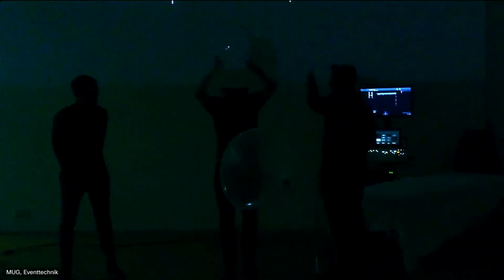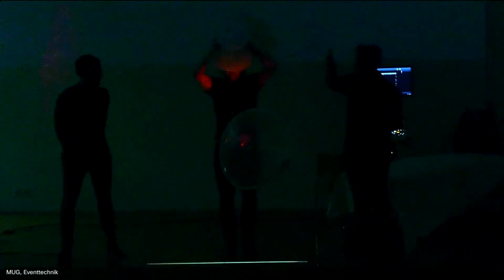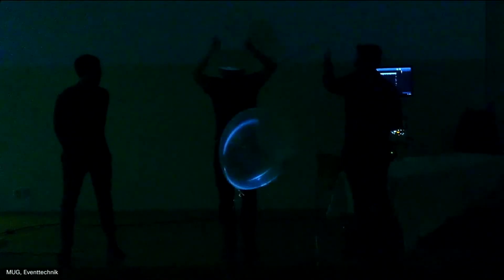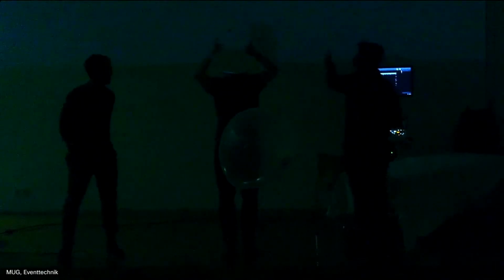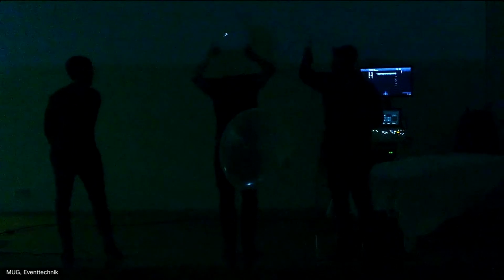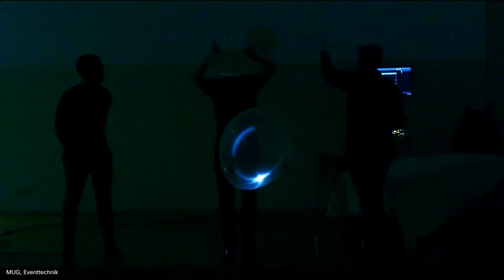Great. So now I would ask you to do a fanning movement. Other direction, please. Yeah. Great. Slowly. Okay, okay. Should I also fan, fan stop, with my body, or? No. You just fan a little bit more and then you stop.